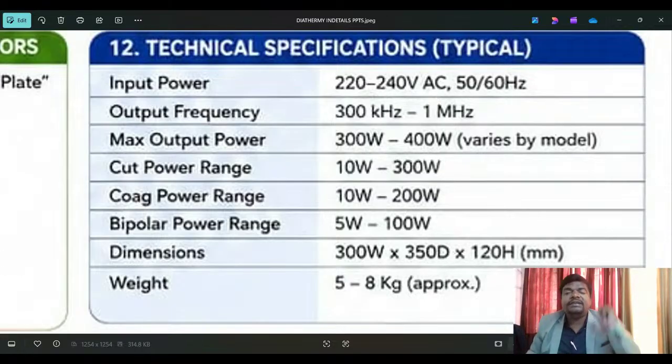If it is not working, then immediately you have to raise the complaint and give the information to the management. Because if you find anything more than 240, more than 250, 260, 270, sometimes even 300 coming, then you should recommend not to use this equipment, otherwise lakhs of equipment will get damaged. You can give the order also, that much capability a biomedical engineer has. If you are following all things and doing all things, then you can demand in these situations also. By doing work, everybody will say, our biomedical engineer is there, he knows very well, so I should be careful. That's why they will give whatever requirements you ask for.